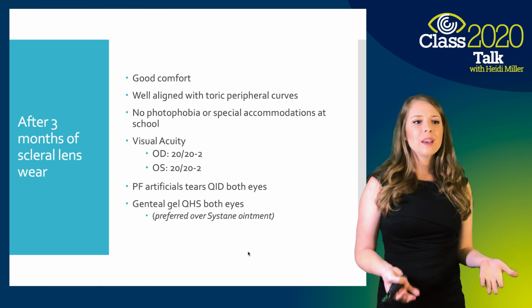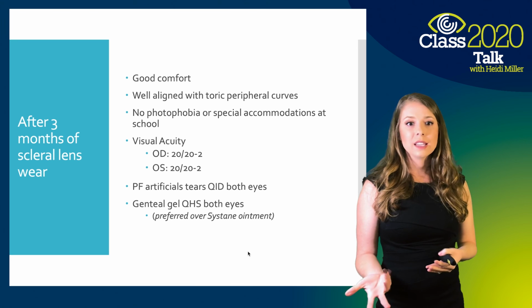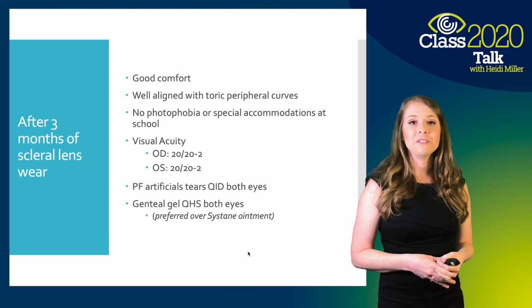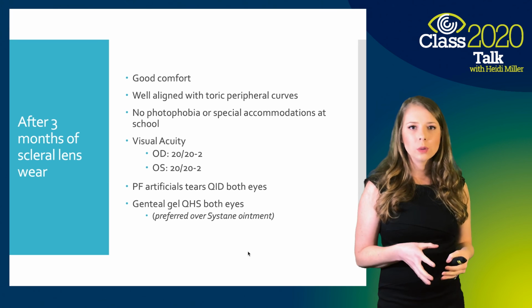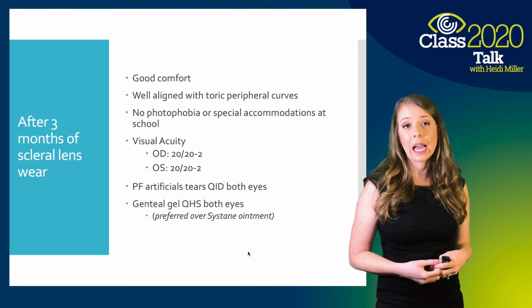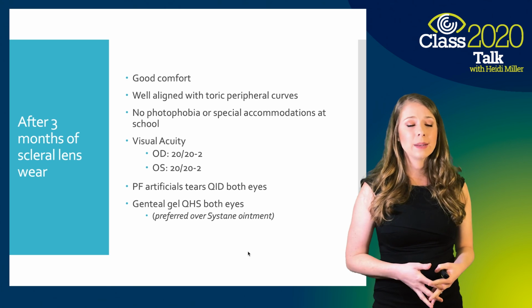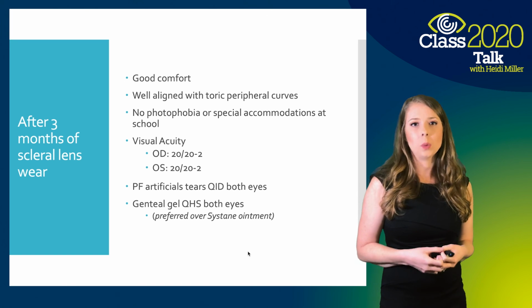And a lot of times we wouldn't think about this for an 8-year-old as being an option, but given her condition, Stevens-Johnson, we needed to do something that was therapeutic and that was going to cover a lot of the eye. And even though it was a really difficult fit in the beginning, encouraging the patient, encouraging the parents, reviewing, I think she reviewed lens insertion and removal with my technician 3 times. And we always encourage them, if the first time you don't feel good and you need to come back a second time or a third time, you are more than welcome to come back as many times. Just schedule with the technician and get all the help that you need, because we want you to be successful and we want you to wear the lenses.